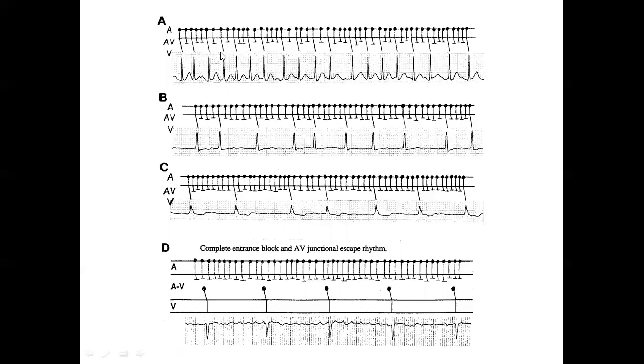Okay, patient is in atrial fib. You rate controlled, then rate became slow with the digitalis. Then later, it became like that and still irregularly irregular. So a lot of atrial activities are blocked, only some are conducted. Then later, the patient's QRS all of a sudden became perfectly regular.